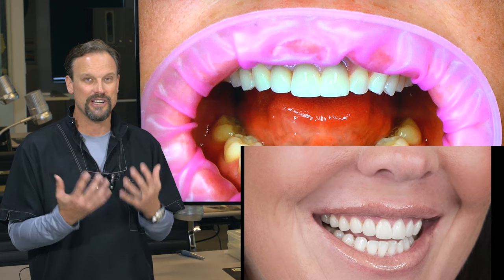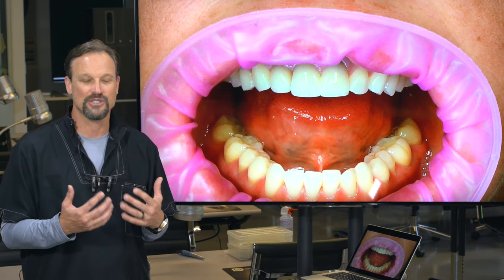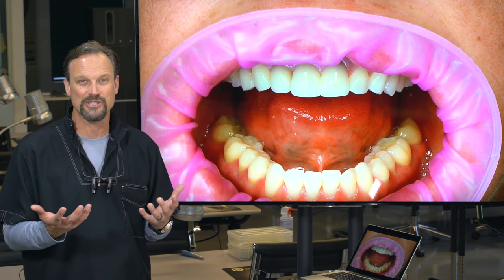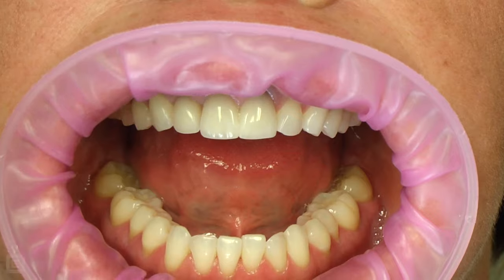With Sirona and the Omnicam system and CAD-CAM milling, you have the ability to have control of your outer surfaces as well as your inner surfaces. And with version 4.5, now that we can take shades, we can even take a shade of the stump or the preparation and know exactly what's going to come through for the optics.